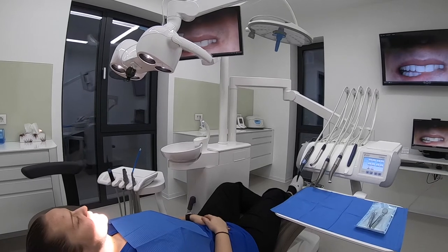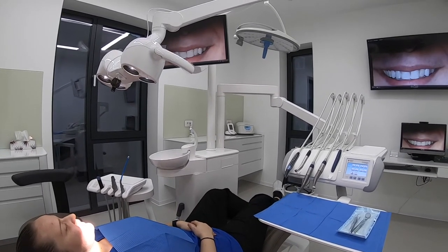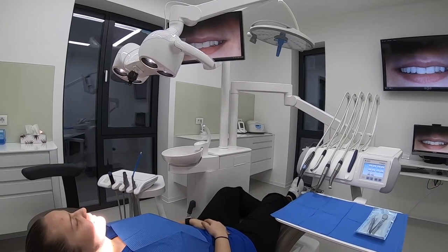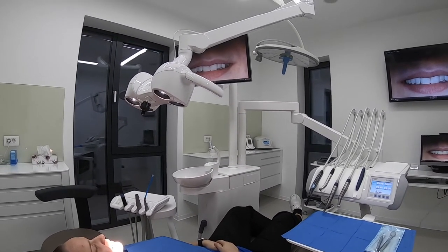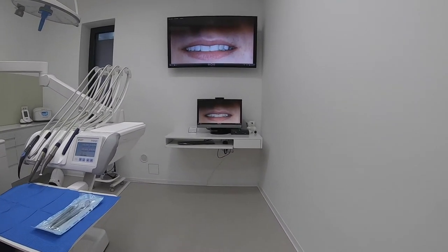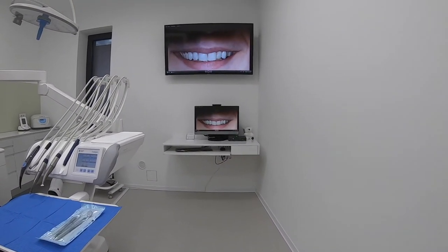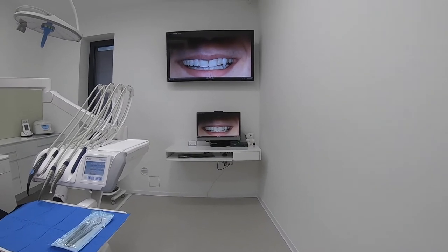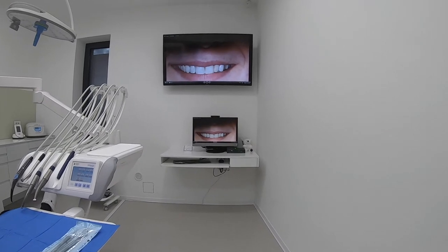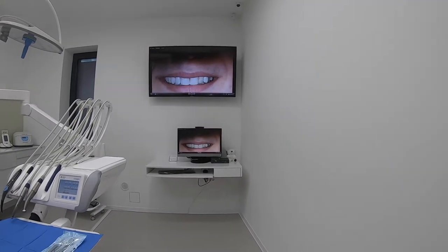But this is not all. In our clinic we have a lecture room and we organize live surgeries. With this setup I'm using HDMI converters to transfer the signal from the camera here in the dental office to the lecture room. I would like to invite you to go together into the lecture room to see the quality of the image.